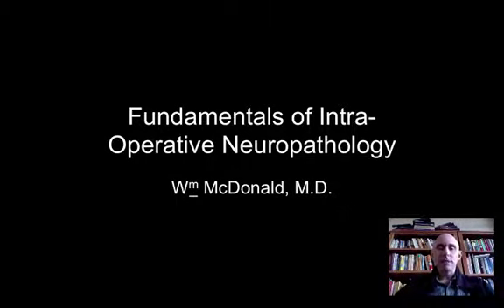This is supposed to cover the fundamentals of intraoperative neuropathology, and for the next 50 minutes or so, we'll be talking about strategies that you can use to improve your intraoperative diagnosis and to have more fun covering brain and spinal cord tumors with the neurosurgeons in the Alina system.